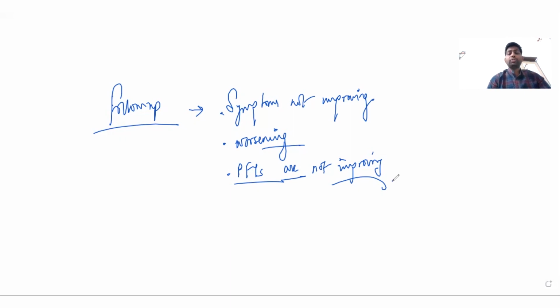because there used to be a method of doing a follow-up CT scan to look for post-COVID fibrosis. But post-COVID fibrosis is commonly seen in most of the patients who have recovered from symptomatic COVID-19. Publications from the current pandemic show that the post-COVID pulmonary lesion starts regressing after 6 months of the disease. In the first SARS epidemic, it was found that after 6 months there was regression of the symptoms and of the lung lesions, and after 7 years they totally disappeared. This trend is expected to be followed in the current pandemic also. Therefore, routine follow-up CT scans are not recommended.